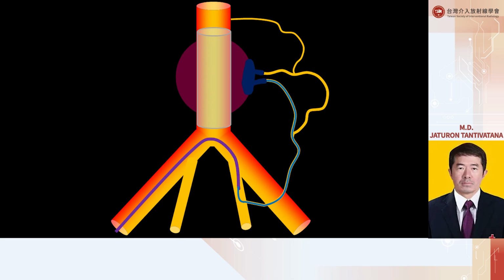If we inject a little bit more and have some reflux back into the feeding arteries from the other branches or another segmental anastomosis, which is quite common in the abdominal or thoracic aorta, we can close the aneurysm quite efficiently. You don't have to close the whole sac with a large amount of coils or glue.